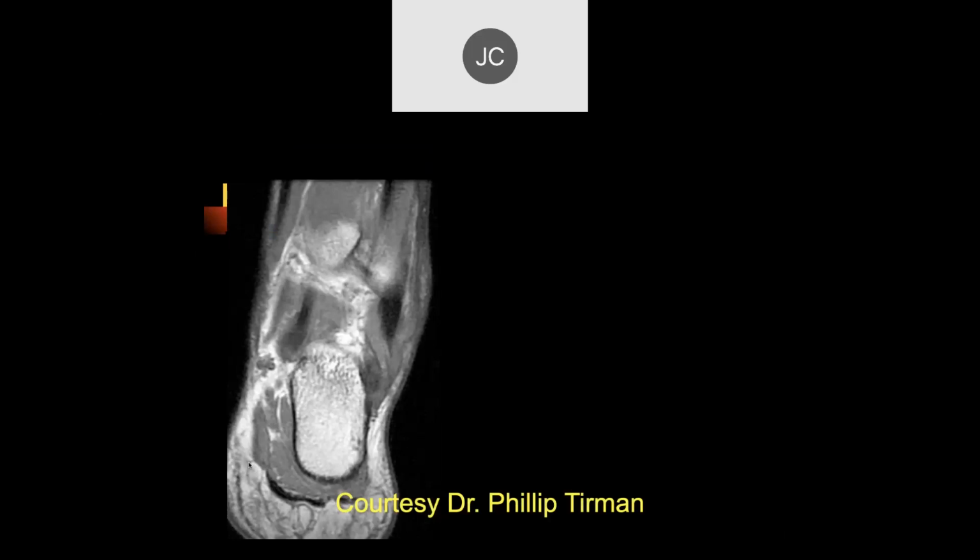Robert, okay, you've got Dr. Tierman to blame for this case. I was gonna say, I don't know what I'm supposed to say. Why don't you look at that right there? All right.